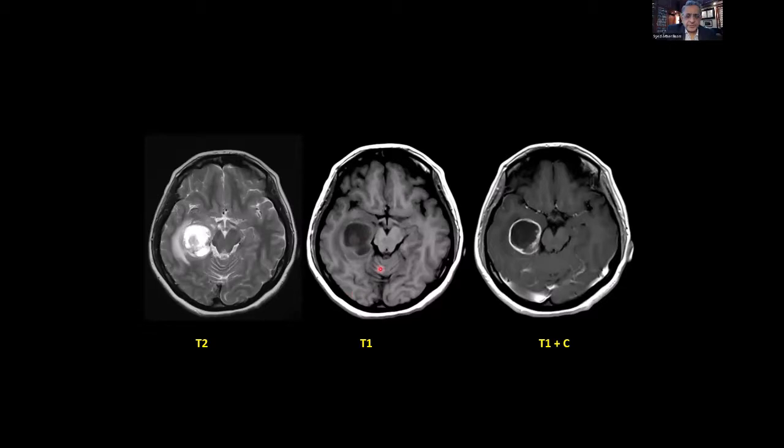So remember that when you have a T1 weighted image, there are only two things that are white. One is fat, like in the skin over here, and the other can be blood, which I'll talk about later. In T2, there can be three things that are white. One is fat, like over here, the fluid, which is white, and then blood in certain stages. Now in T1, the third thing that can become white or hyperintense is when you give contrast and it takes up the contrast. That's the third thing, or the blood vessels like these over here.